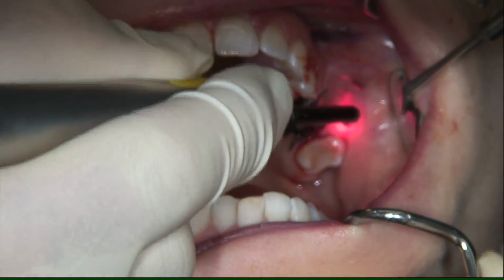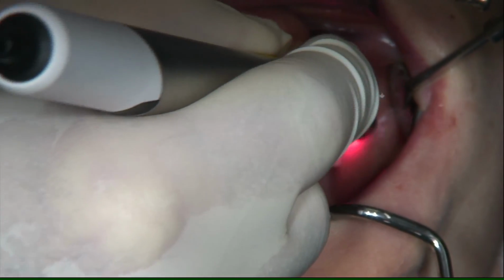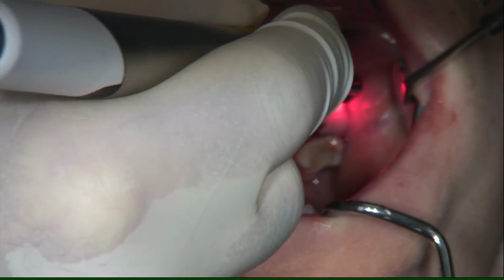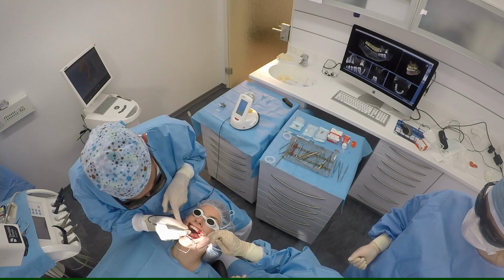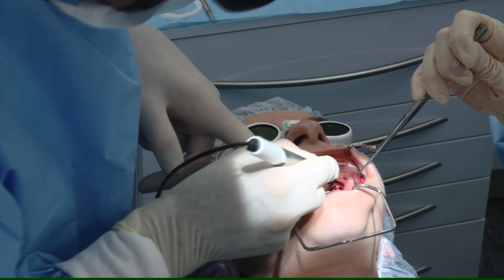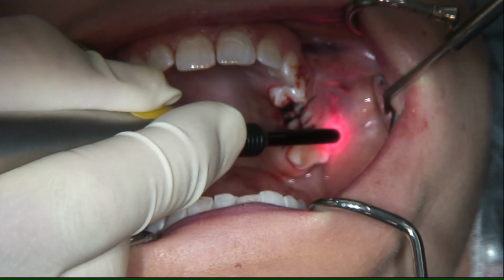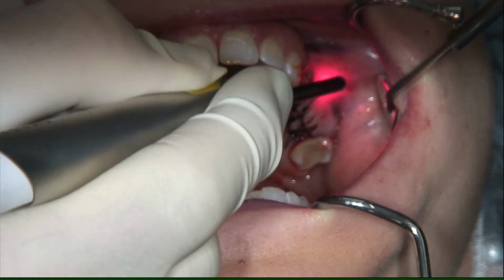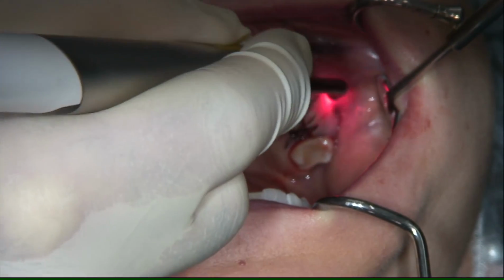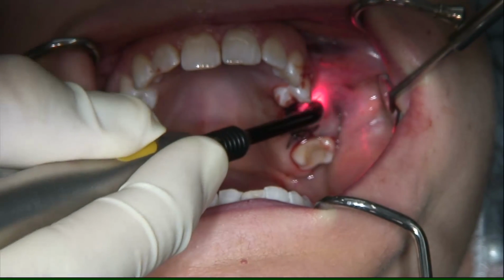So the diode is used to reduce the bacterial levels, and the result is a better long-term prognosis. It's also used in periodontology and endodontics. The time you're using this soft laser on average is around 120 seconds.